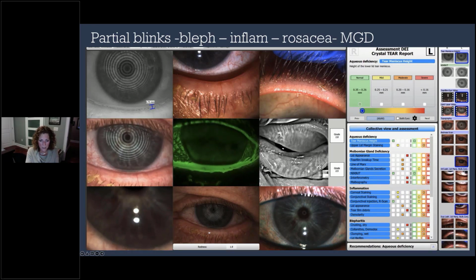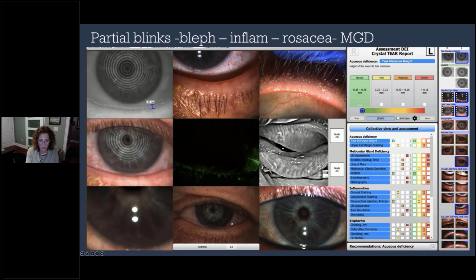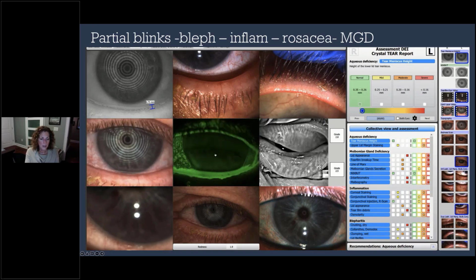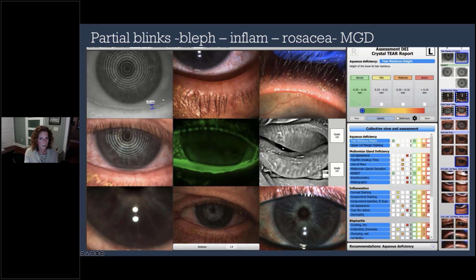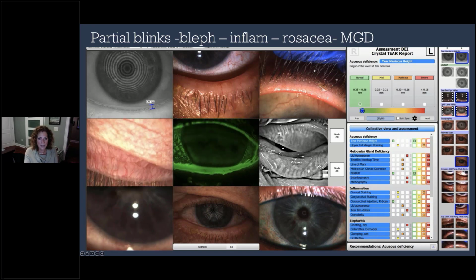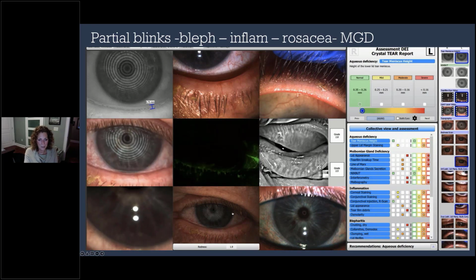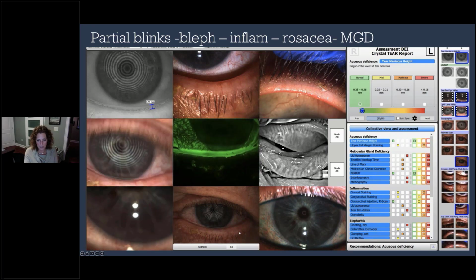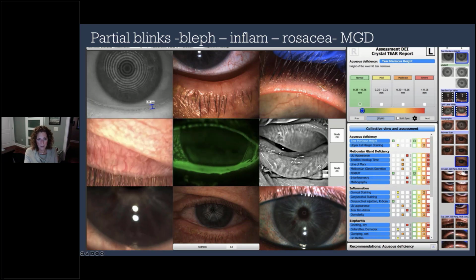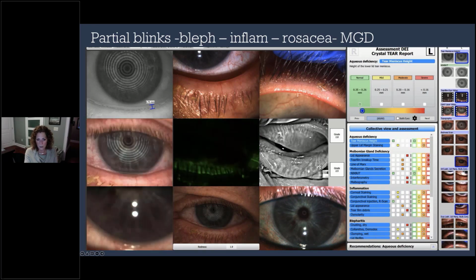Look at this image, look at this lid margin, how it's thick and rolled, and the redness on the eyeball. Little tiny bit of staining, not much. Ultimately with this patient, we are going to take care of that blepharitis, right? We're going to get them hypochlorous acid, maybe at-home blepharoexfoliation. This patient needs some anti-inflammatory. So I would start out with IPL, but ultimately they may also need thermal evacuation to empty these glands out so we don't lose more.